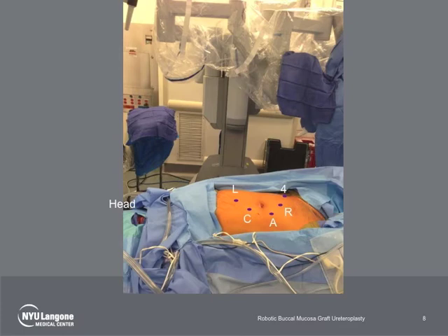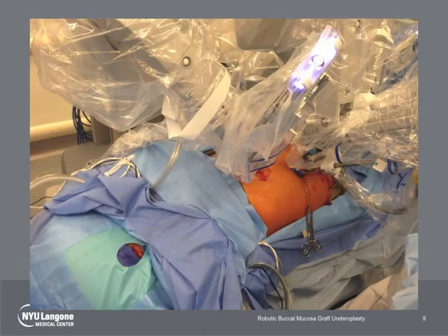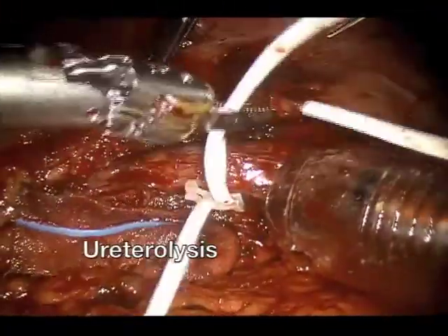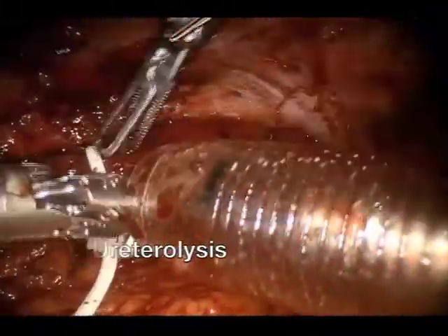The patient was placed in a modified right lateral decubitus lithotomy position, which allows for bladder access. Port placement was similar to that for pyeloplasty. The endotracheal tube was secured down on the right side of the mouth, and the mouth was draped separately from the abdominal field in preparation for buccal mucosa harvest. The procedure was begun like a pyeloplasty.